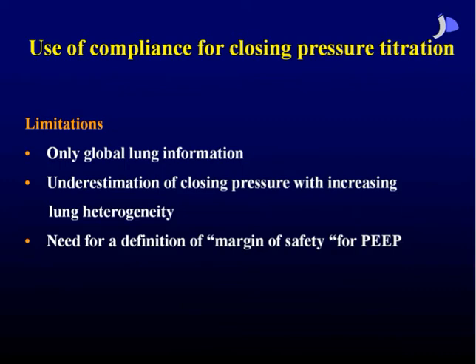Turning the patient prone changes the vertical pressure gradient. I have never done it, but my guess is that you probably will have a relatively more stable situation. The PEEP level would be a little bit lower than needed, but then you have to take precaution whenever turning the patient back, because the situation changes, and then you can lose everything because your PEEP level is not enough. But I do think that there's a synergistic effect.